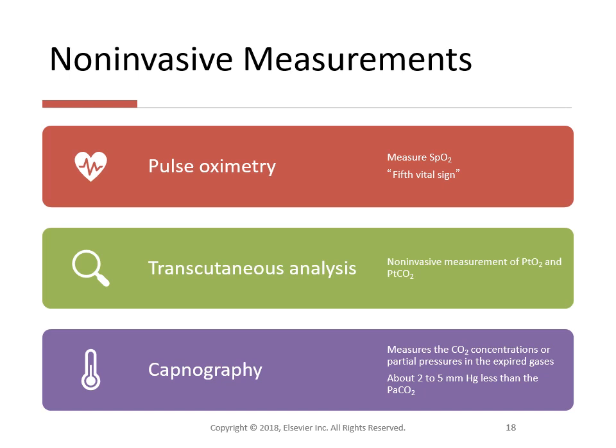Computed in this manner, SpO2 often is called the functional saturation. This simply means the percentage of the normal hemoglobin that is actually bound with oxygen.